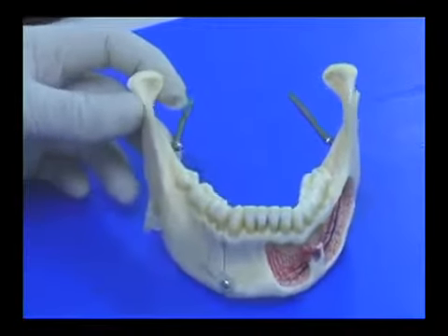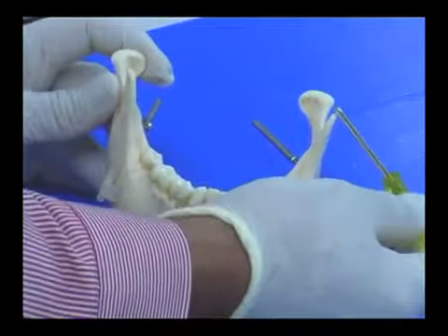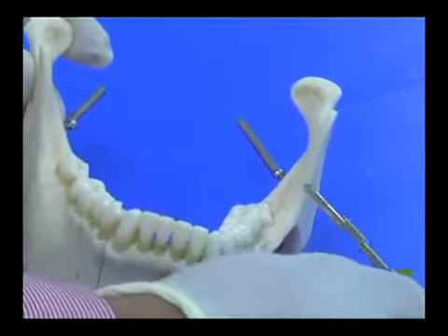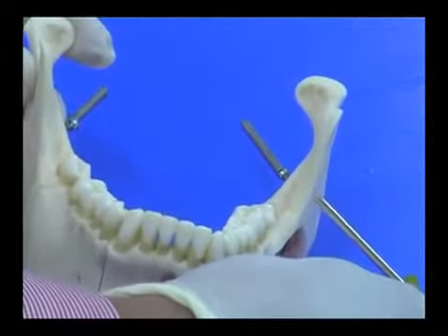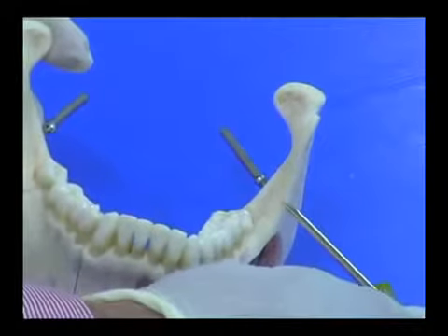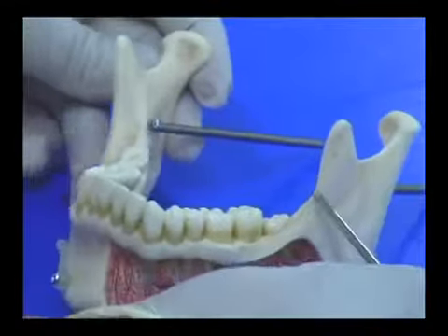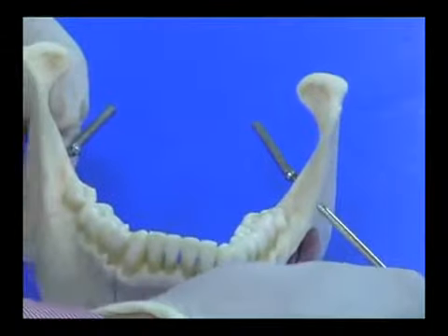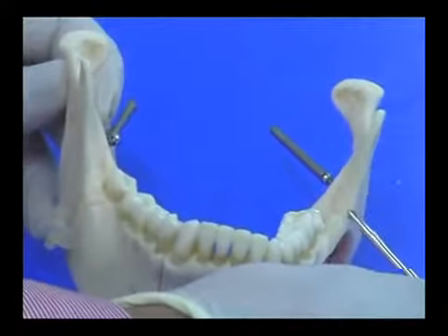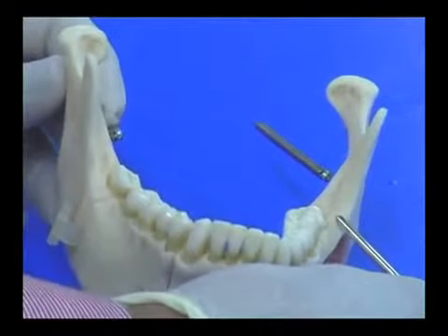This is a model of mandible which is showing the coronoid process there, and we have to identify in a patient the coronoid notch, which is the deepest concavity on the anterior border of the ramus of the mandible. We can easily identify or palpate that in a living patient. This is also called the external oblique ridge.